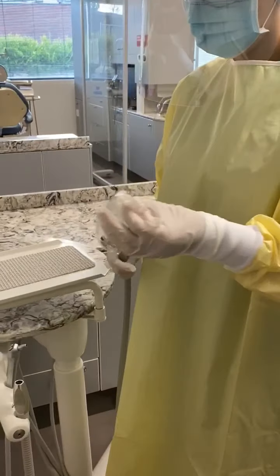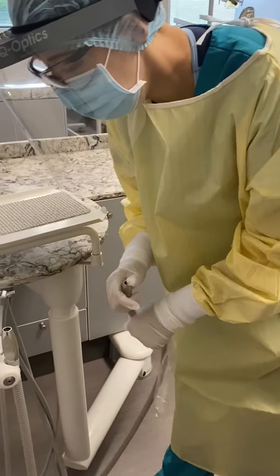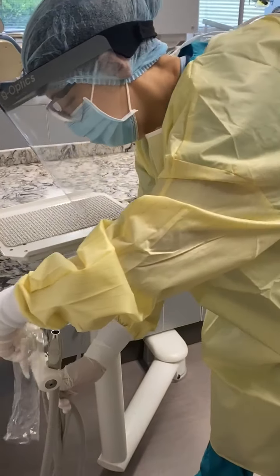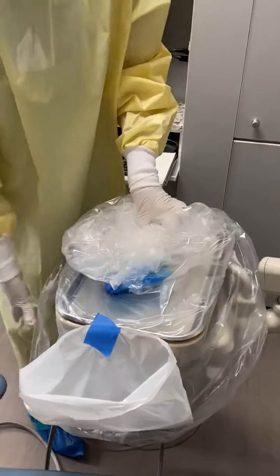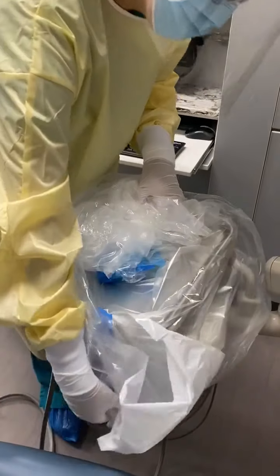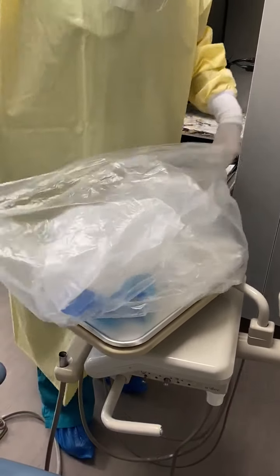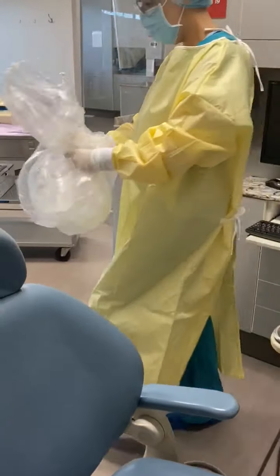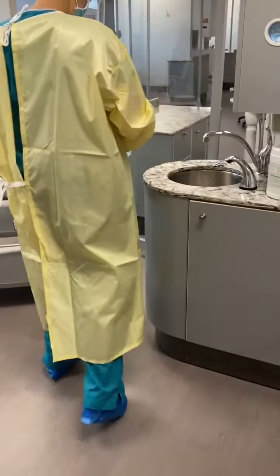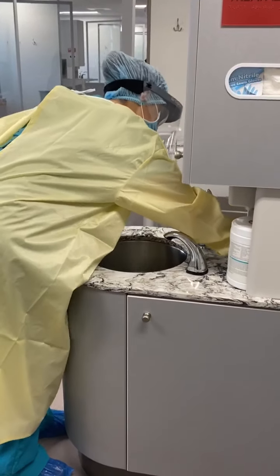Once you have removed all of the barriers, you will now turn the bag inside out, keeping the contaminated barriers on the inside of the dental chair bag, so that once you have pulled everything out, you have a nice bag to thread into the trash receptacle.